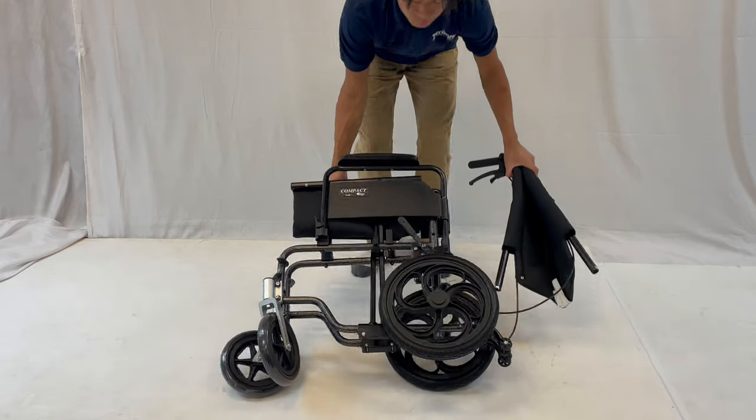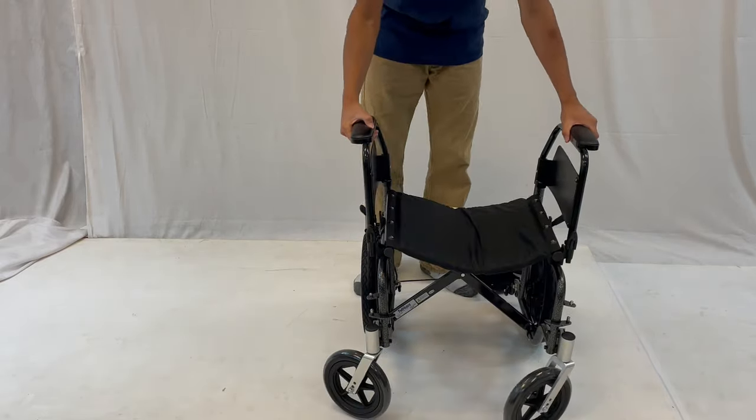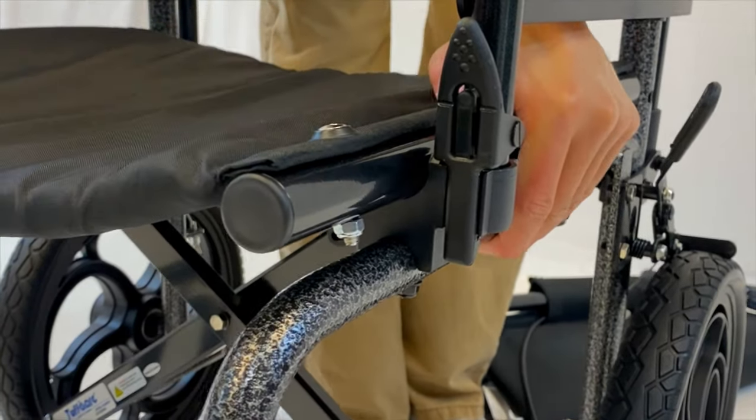Readjust the main frame so it is upright and open up the wheelchair. Push down and make sure the seat clicks.